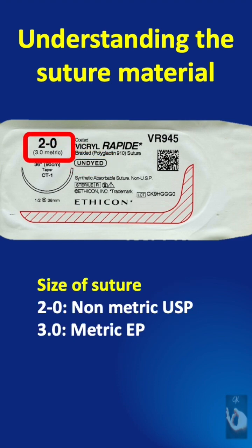This denotes the size of the suture. 2-0 is the non-metric size according to the United States Pharmacopeia, and 3-0 metric as given in the European Pharmacopeia.